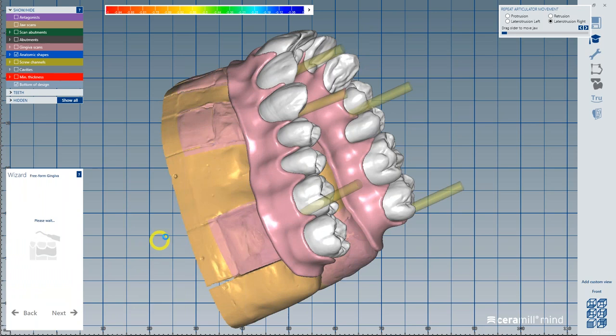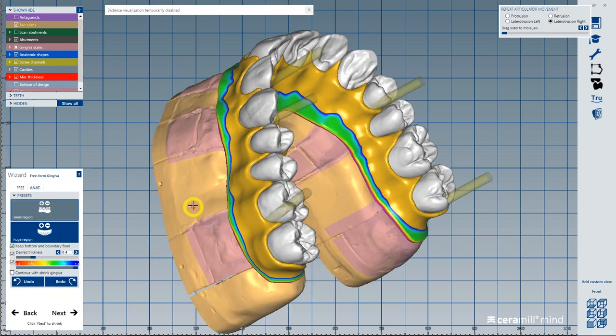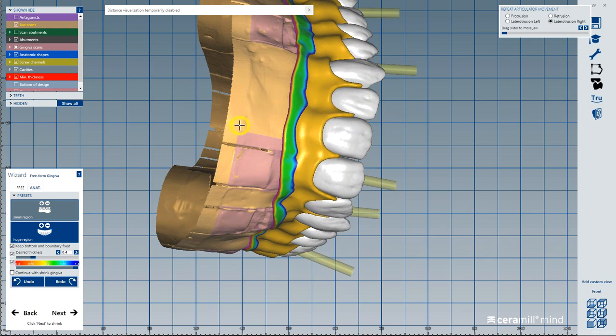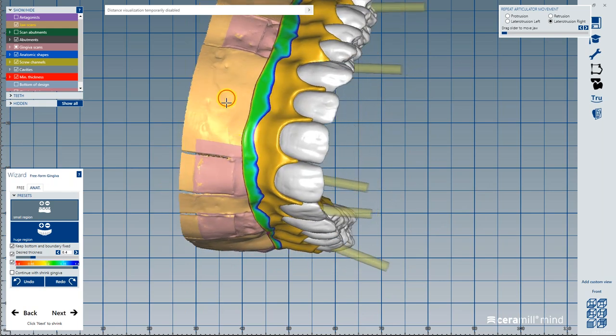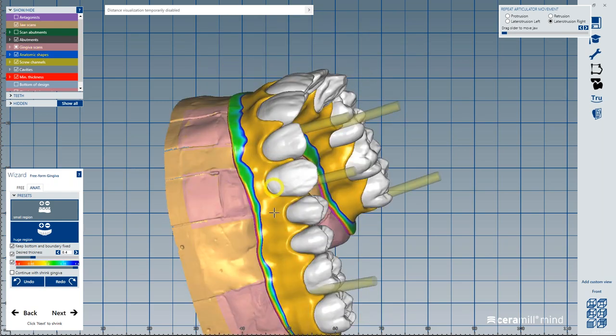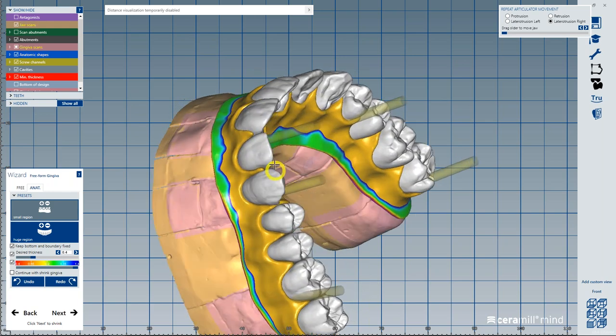Okay, so now we're on to freeforming. Two trains of thought here. If you're going to add a lot of gingival material, you want to keep this smooth. Don't worry about a lot of festooning and spending a lot of time here. You just want it nice and smooth. You want your embrasures filled.